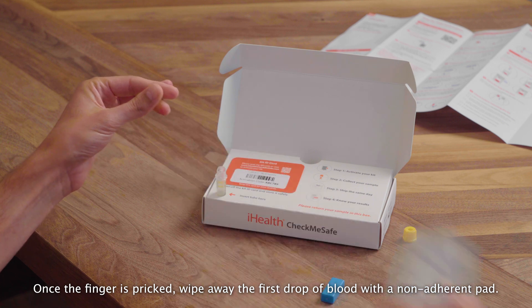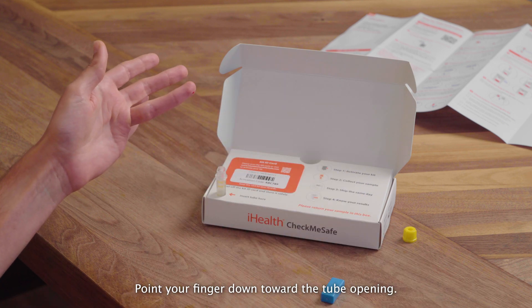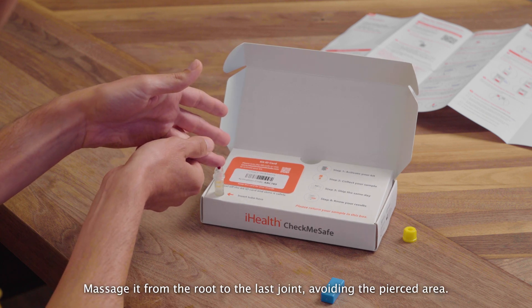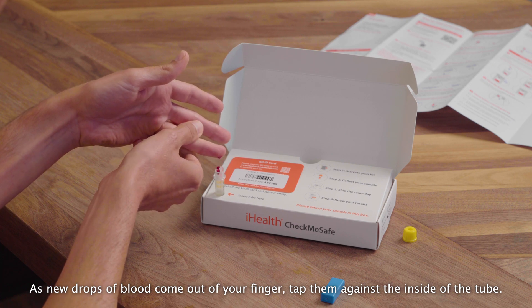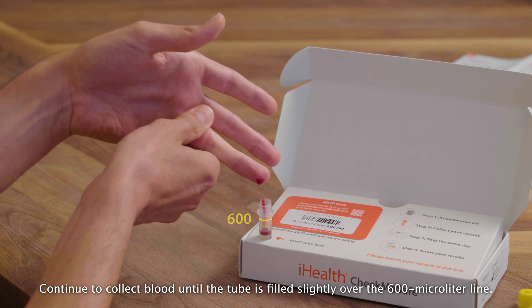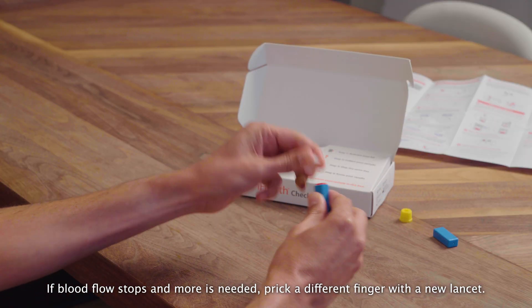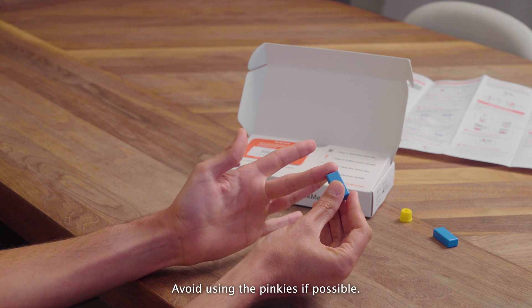Once the finger has been pricked, wipe away the first drop of blood with a non-adherent pad. Point your finger down toward the tube opening and massage it from the root to the last joint, avoiding the pierced area. As new drops of blood come out of your finger, tap them against the inside of the tube. Continue to collect blood until the tube is filled slightly over the 600 microliter line. If blood flow stops and more is needed, prick a different finger with a new lancet. Avoid using the pinkies if possible.